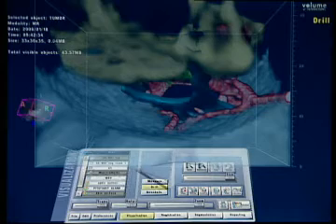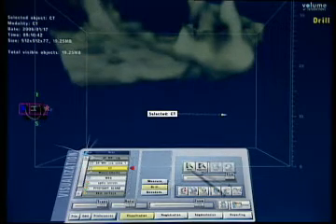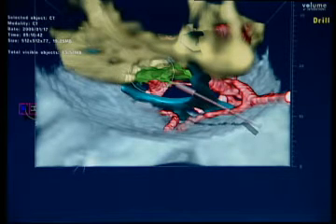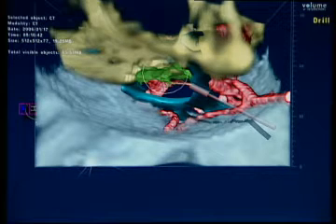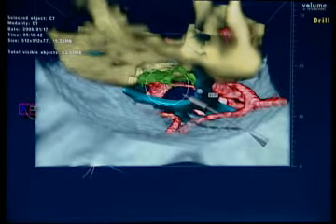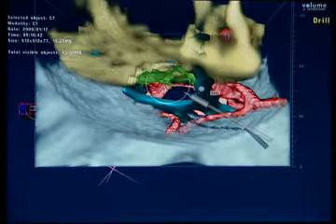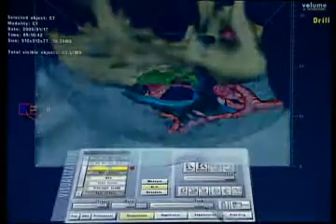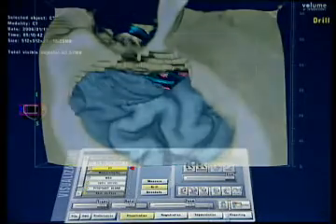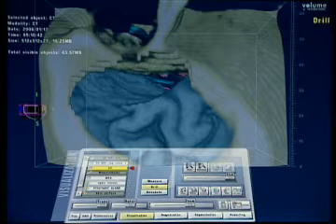we drilled that. So you can see, you can drill the planum and the tuberculum, and this is already the most inferior extent of the lesion. So by doing that, by drilling the tuberculum a little bit away, you don't have to unlock the optic nerves by opening the canals of the optic nerves. You can pretty comfortably, through this approach, take this guy out. So that's why we decided for that approach. In about skin to skin, less than 3 hours, the lesion was removed completely.